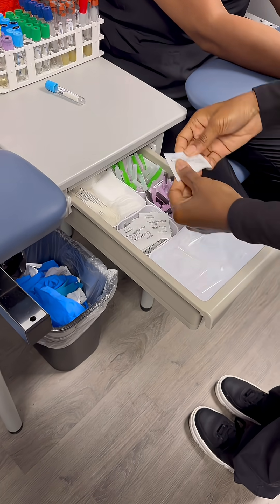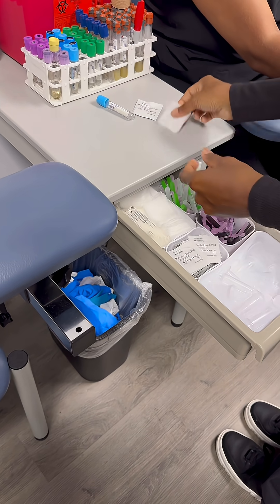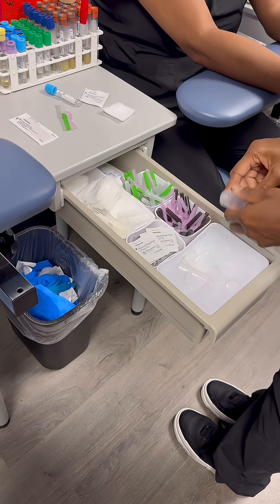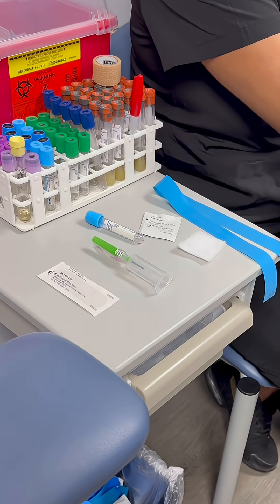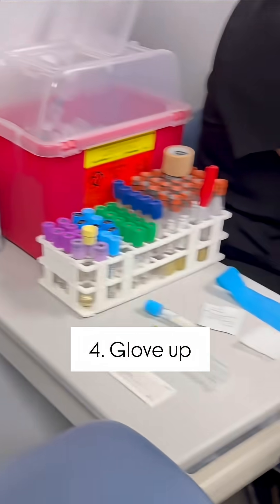Here is where all your supplies are. I'm going to go ahead and grab your alcohol pad, get your gauze — I normally do two — get your needle, your band-aid, get your hub, and go ahead and connect it immediately. This is all the supplies that I will need to draw blood. Before you start, just double-check, triple-check, make sure you have everything you need. Now I'm going to go ahead and grab my gloves.